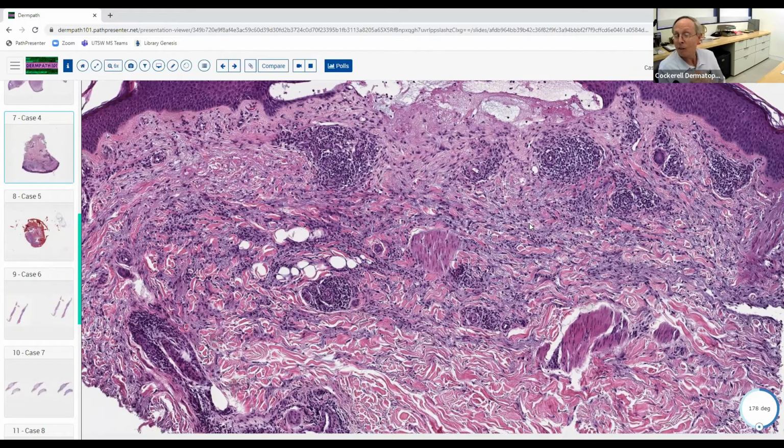we think about the palisaded granulomatous dermatitis like granuloma annulare; necrobiosis lipoidica can do it. Scleromyxedema, you can get interstitial histiocytes and fibroblasts in that condition. Some infections sometimes can do it. And then the so-called interstitial granulomatous dermatitis associated with connective tissue diseases like rheumatoid arthritis and sometimes with lupus, the so-called Winkelmann granuloma, not Wegener's granuloma. These give you that same sort of interstitial pattern, often with some neutrophils and some collagen degeneration.